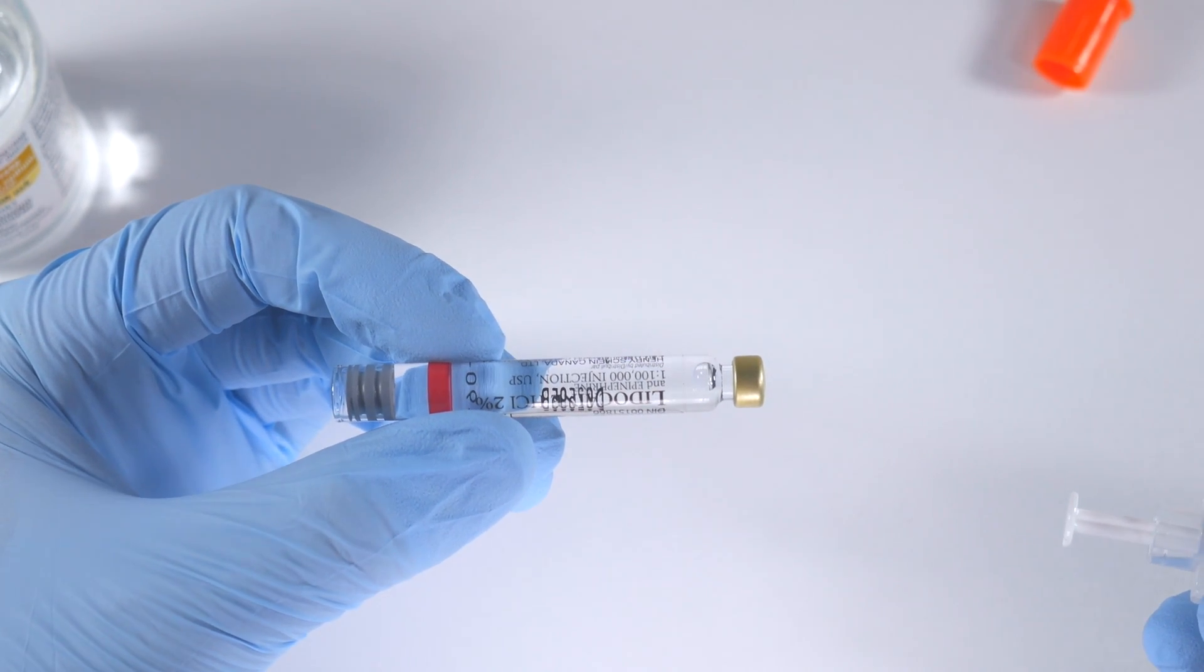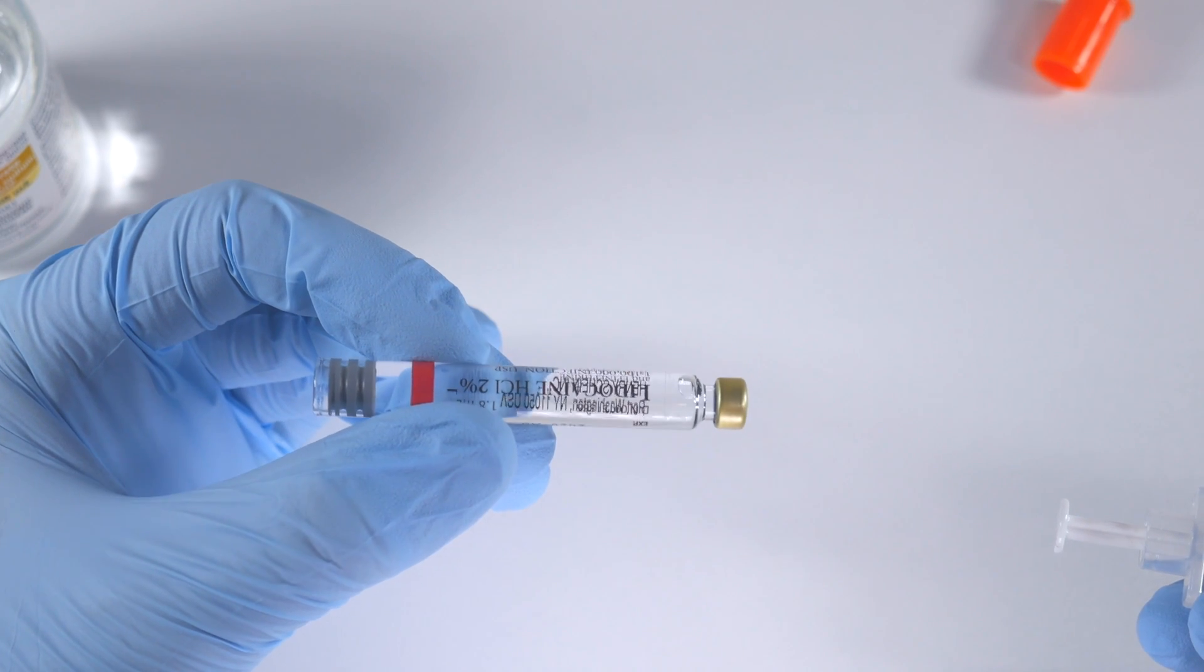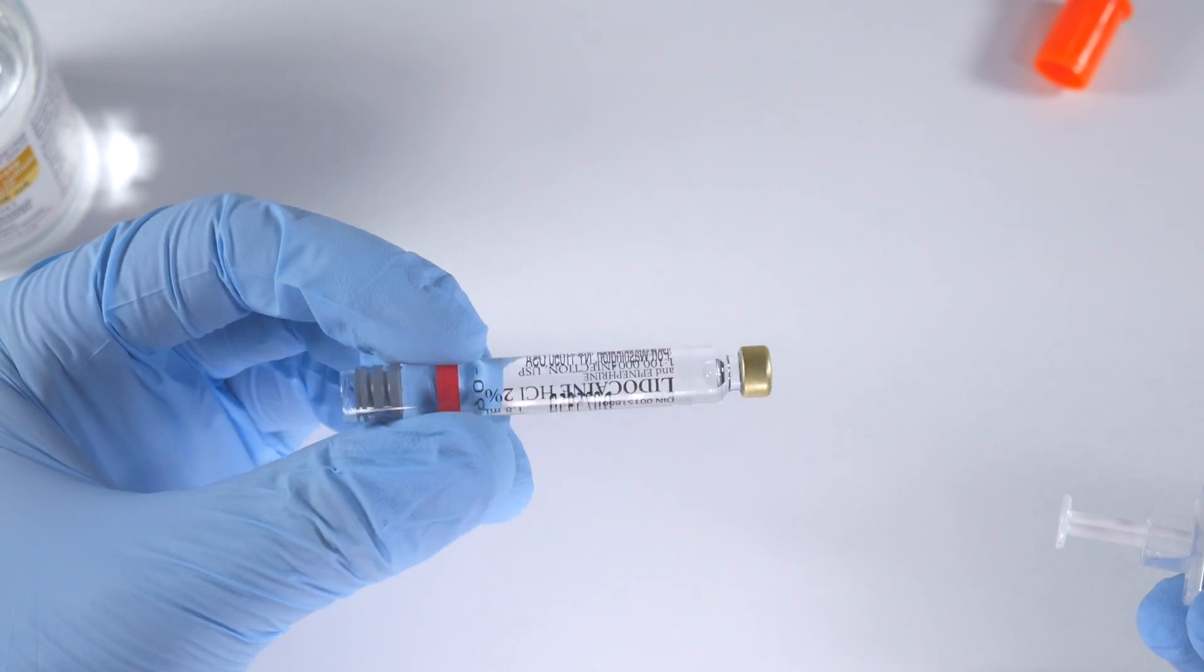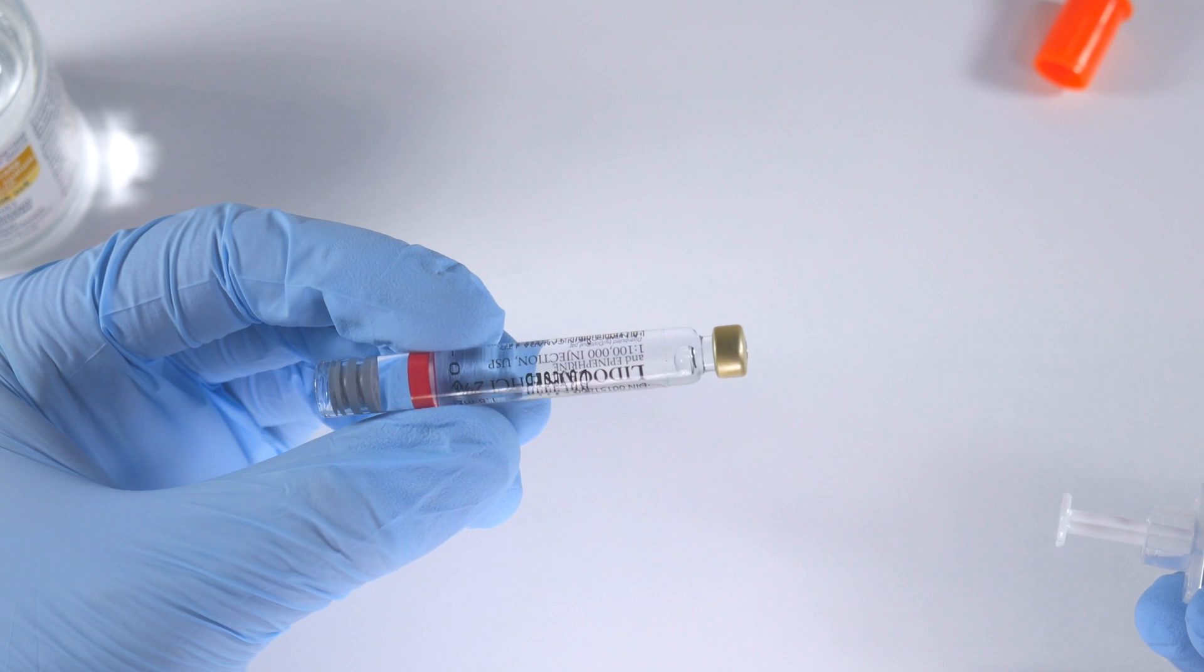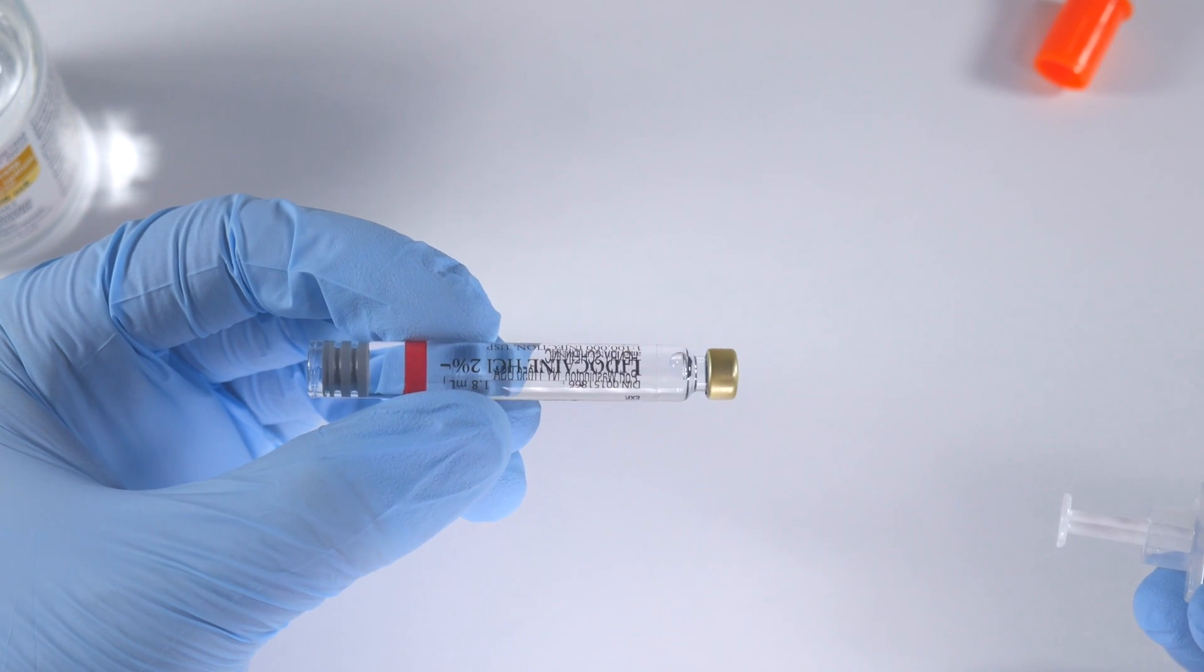I wasn't sure what exactly was happening within the carpule. Now this really clears it up, and I don't think I'm even going to talk - I'm just going to do it and the results will speak for themselves.